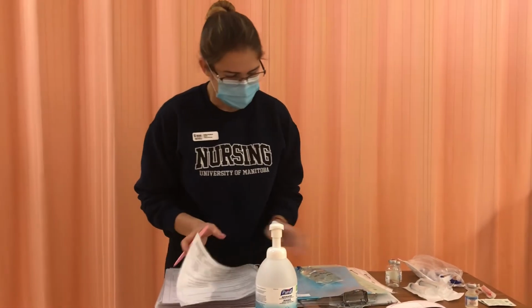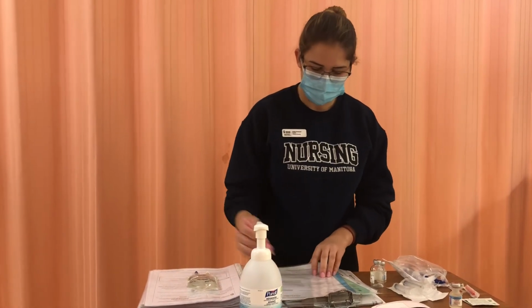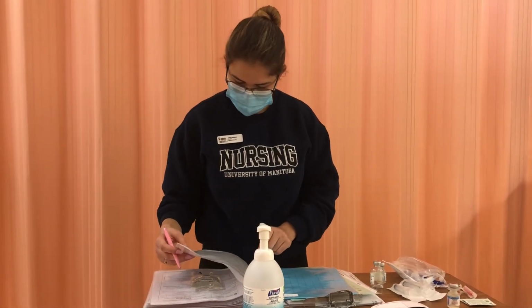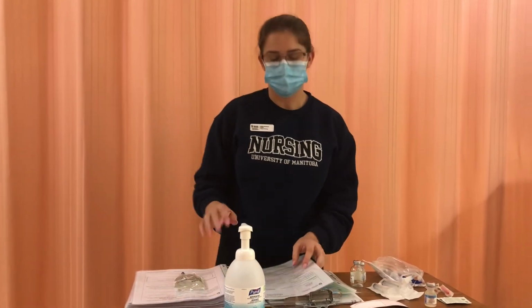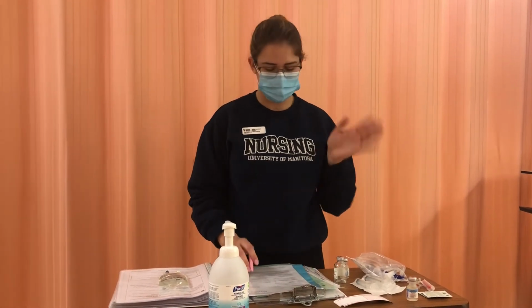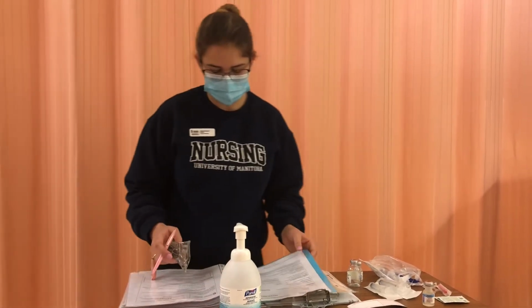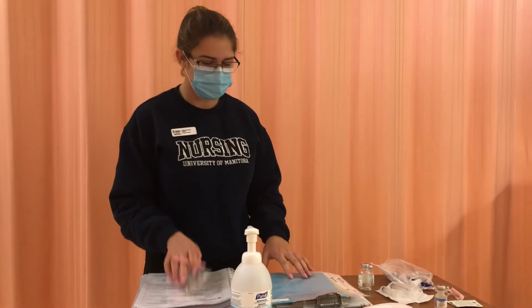Okay, so I'm just checking a few more things on my PDM. My maximum rate is over 30 minutes, and I'm going to be below that. My maximum concentration, once I've reconstituted, is going to be 250 milligrams per mL, but it'll be further diluted in 50 mLs, so it'll be well below that. It's compatible with normal saline, which is good because that's what's in my primary infusion and what's in my mini bag. I'm going to be monitoring for diarrhea, nausea, and a hypersensitivity reaction, so I'll be asking her to watch for a rash. Okay, so that's my PDM.